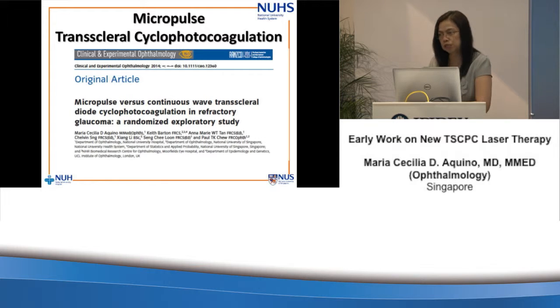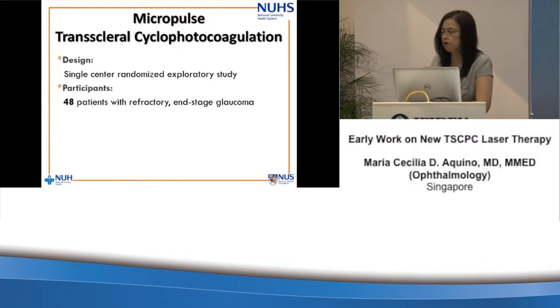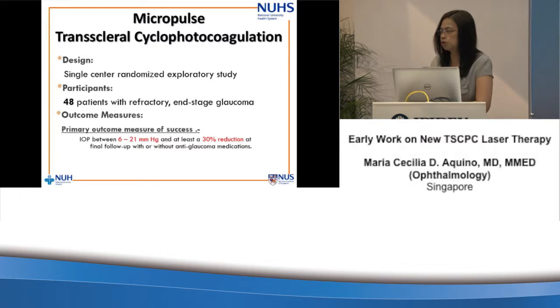We did a comparison exploratory study. We compared the micropulse delivery mode versus the continuous wave delivery mode in transscleral diode cyclophotocoagulation. This is a single center randomized exploratory study. We involved 48 patients with refractory end-stage glaucoma, and the outcome measure this time was an eye pressure, IOP, of between 6 to 21 and at least a 30% reduction at the final follow-up, with or without glaucoma medications. The secondary outcome measures were complication rates, the number of medications, and repeat treatment.